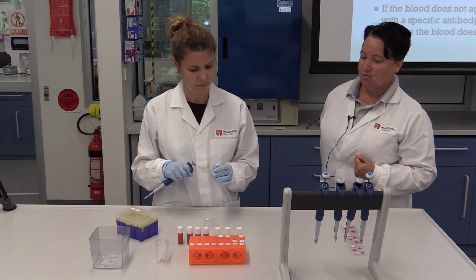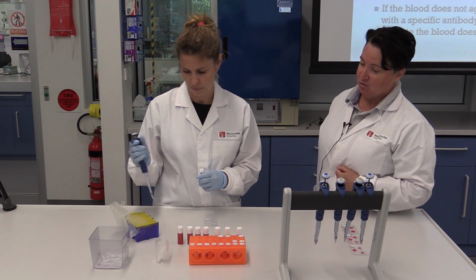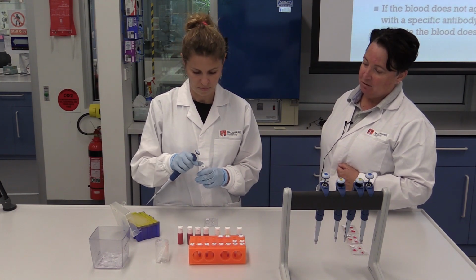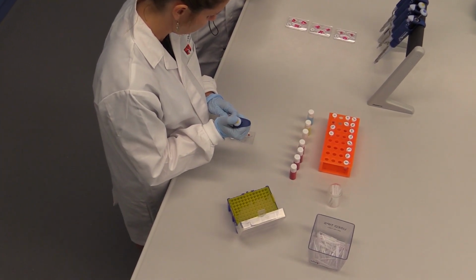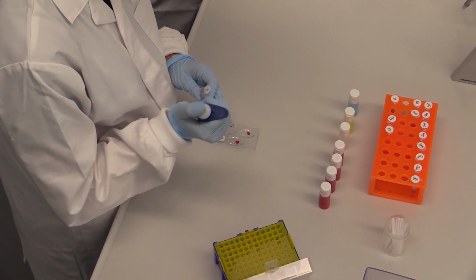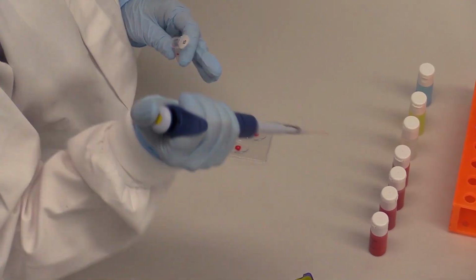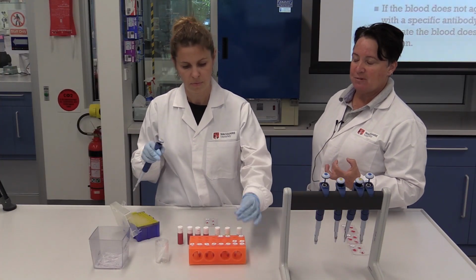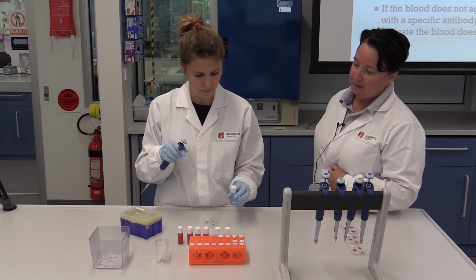So Fleur is going to dispense our B sample, our positive control. She's taking 20 microlitres and transferring it into each of the 3 wells on the test plate. Notice in this situation she's used the same tip. That's because she's transferring the same sample, so that's okay.